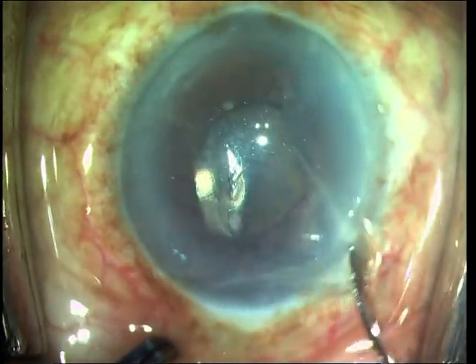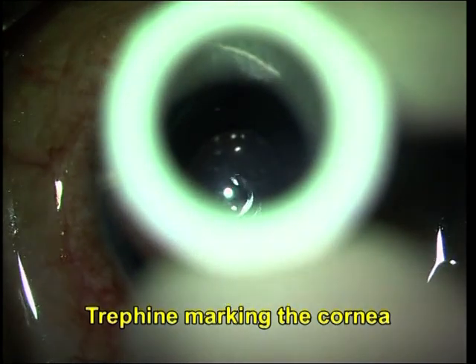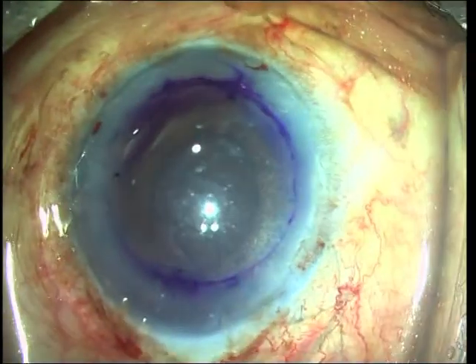Edematous epithelium is removed for better visualization. The cornea is marked with a trephine. Knife entry is then made into the anterior chamber.